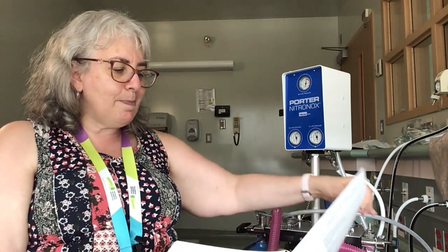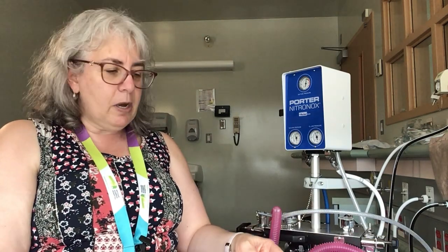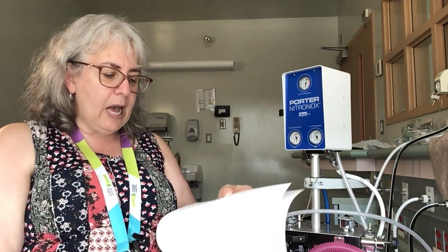We're going to be setting up resuscitation equipment for both the birthing parent and the baby as part of our procedure, as well as continuous presence must be maintained by the RN or the RM while the patient is using the nitrous oxide gas.